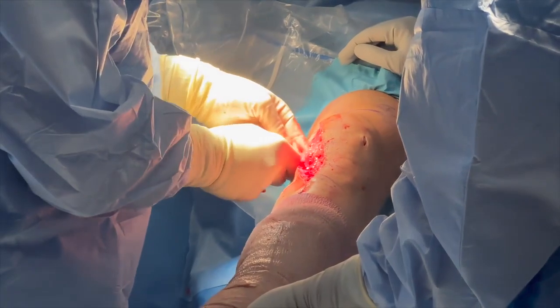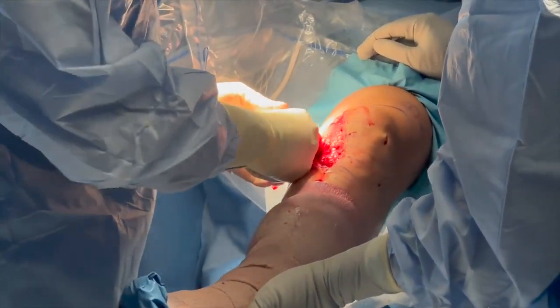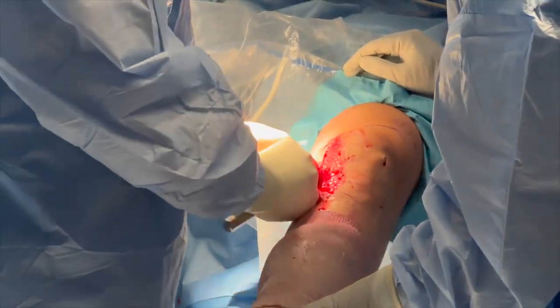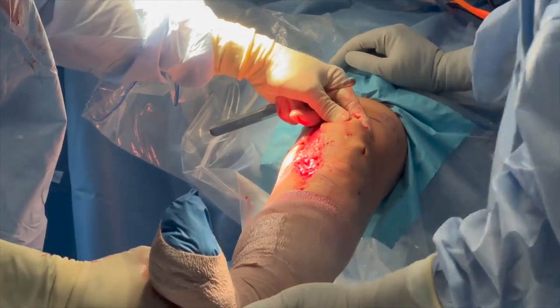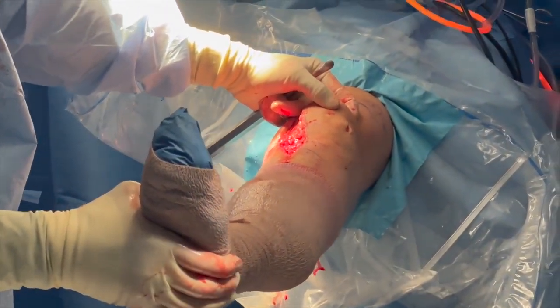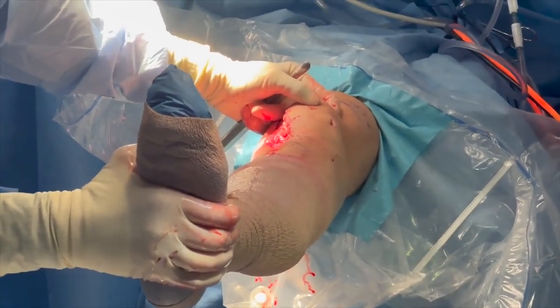In this patient, the popliteal artery and vein are less than 5 millimeters away from the posterior capsule. Therefore, an open approach will provide better visualization and reduce the risk of iatrogenic damage to the vasculature. However, an arthroscopic release may be indicated for other patients.